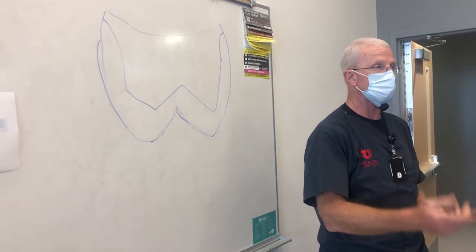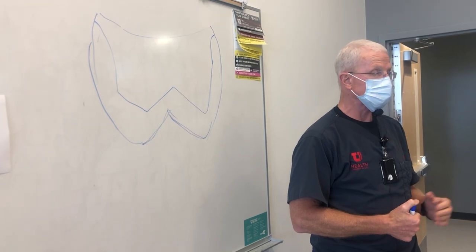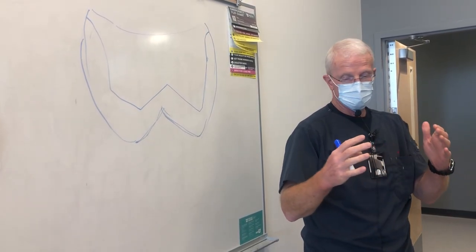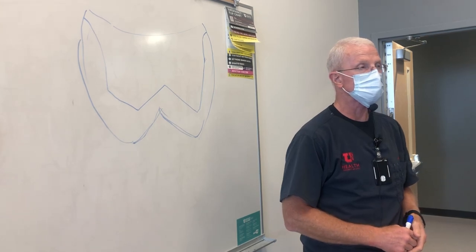And hopefully by practicing on these type of teeth, you get a pretty good feel for what your preparation looks like. Even though every tooth you prepare is going to be unique, you kind of know what a full zirconia crown for an upper molar looks like, or a lower molar looks like.